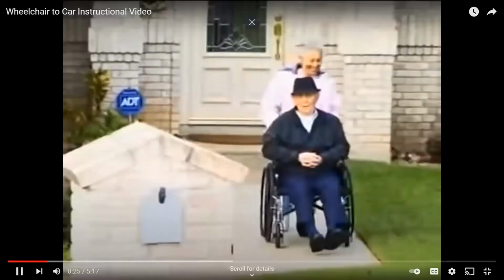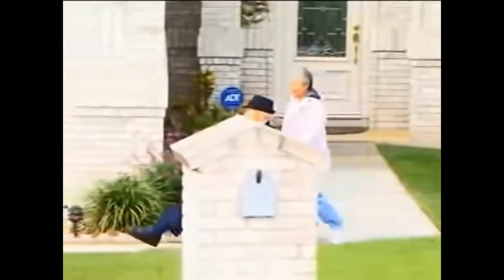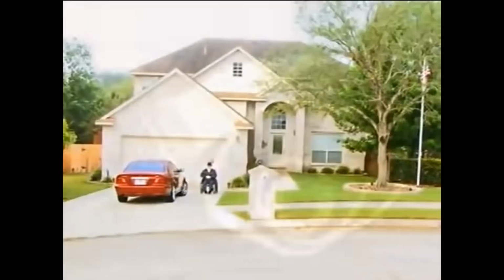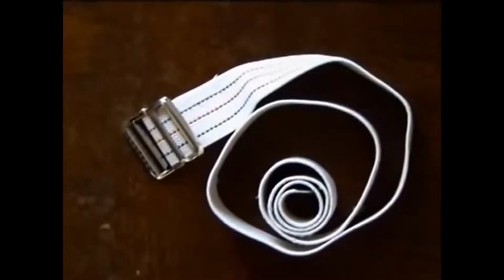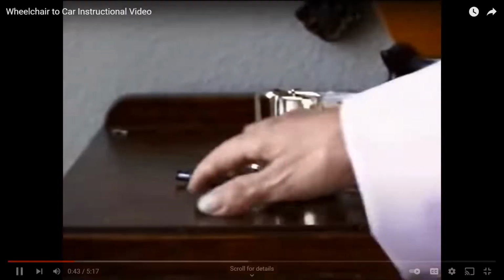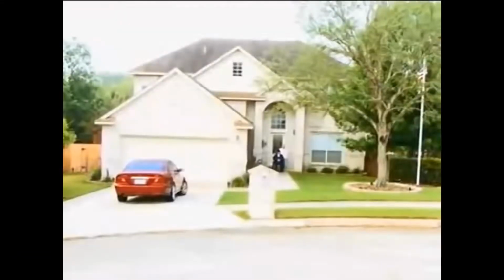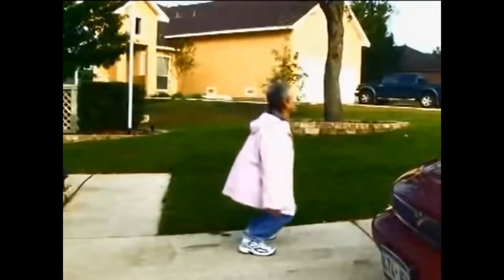Taking a wheelchair-bound loved one outside of the home may first require the caregiver to get them into a car. Before starting the transfer, it is important to remember a few key things. First, be prepared by gathering any items you need before you start. Have your keys, gait belt, and any other items handy before you go outside. Move the car to a location that would allow easy access for the wheelchair. Protecting your back from injury should be part of every transfer. Good body mechanics involves bending your knees during the transfer and maintaining natural curve in your back.